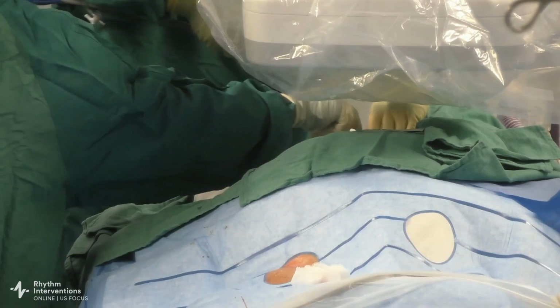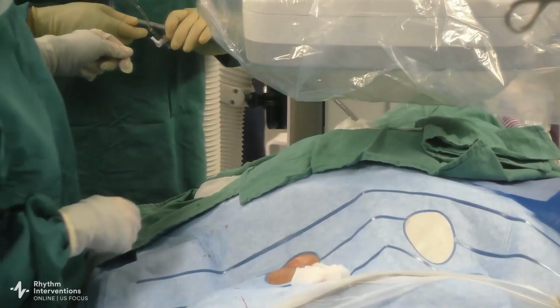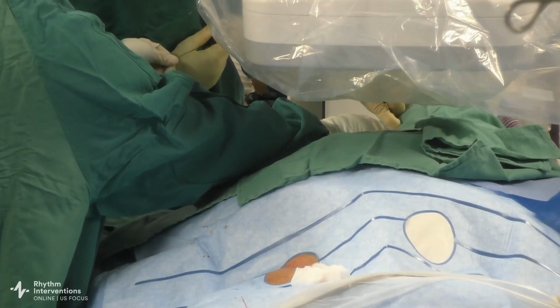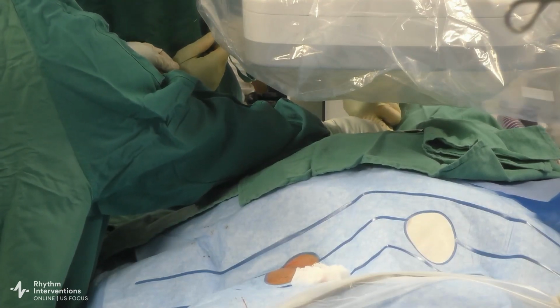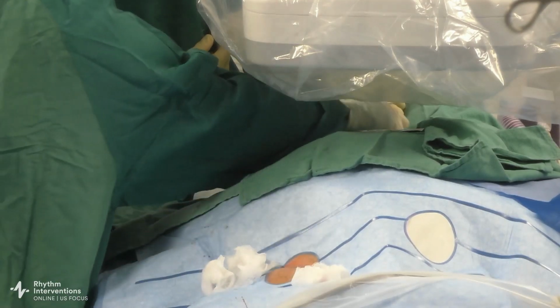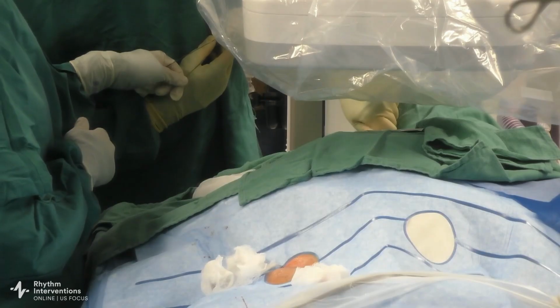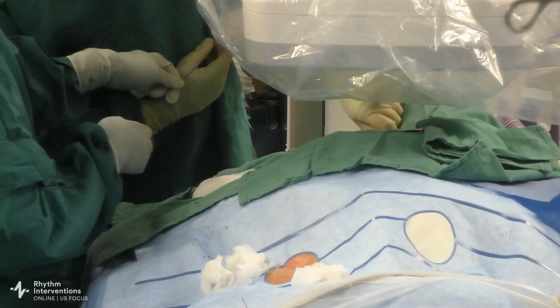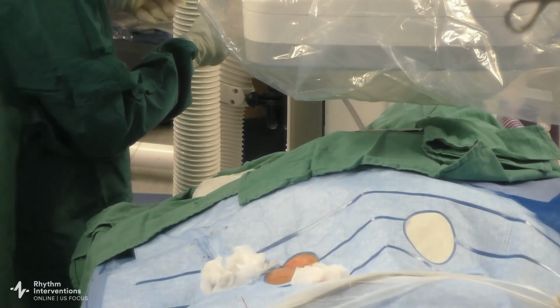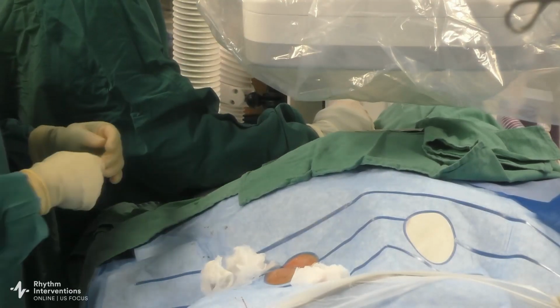All right. Here. Okay, so here we need to look under X-ray. One second. Make sure you look. You have to go coaxial. Is it going? Okay. No. Resistance or no? Let me see. Okay, just try again. Okay, let me try it for a second. Would it help you if I swung this? Yeah, maybe. Just keep it for now.